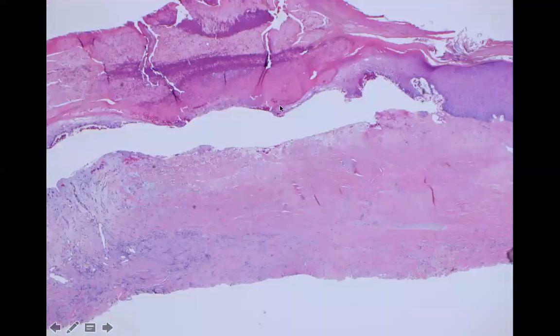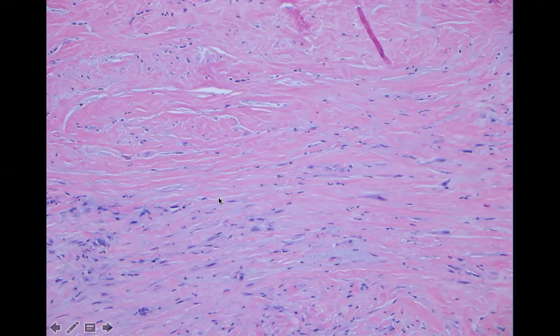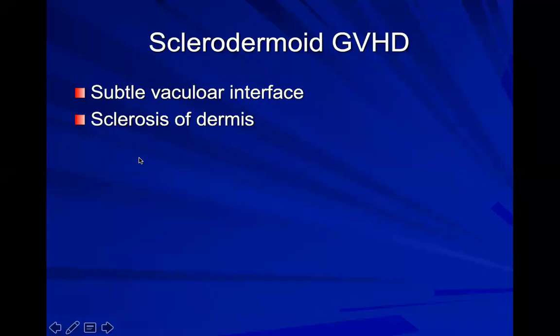Here's an example of an ulcerated lesion of chronic radiation dermatitis. When you have your ulcer, you'll have granulation tissue, and early on you'll have fibrosis, which you have here, where it's more cellular. But with time, you will go on to progress to sclerosis. And here again, look at these big fibroblasts. So big fibroblasts, big dilated vessels in sclerosis, think about chronic radiation dermatitis. And here you're going to see plasma cells, because anything going on for a long time, you'll have plasma cells. You might see some eosinophils. You can see anything in the inflammatory areas, especially if they're traumatized.